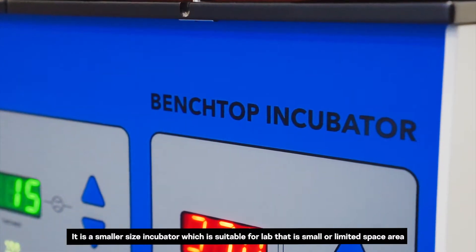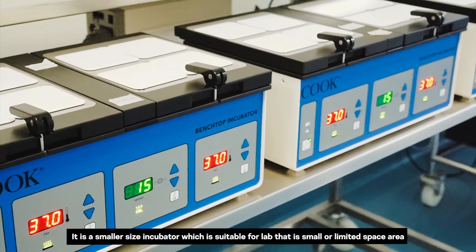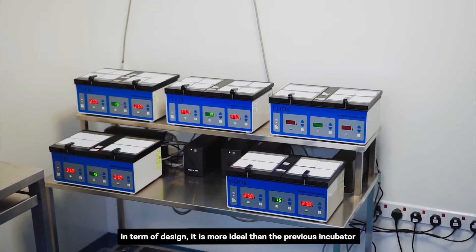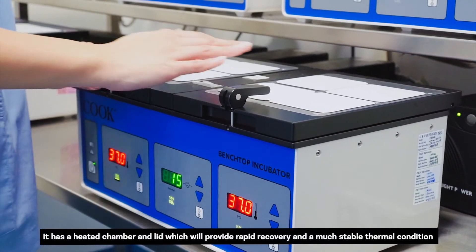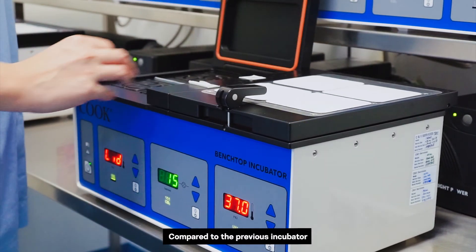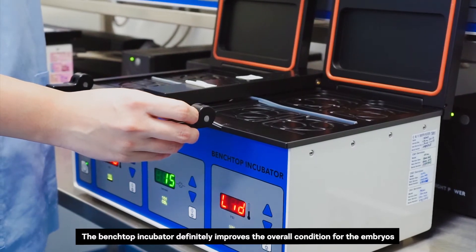Here we have another type of incubator, the Ming Benchtop Incubator. It is a smaller size incubator suitable for labs that are small or have a limited space area. In terms of design, it is more ideal than the previous incubator. It has a heated chamber and lid which provides rapid recovery and a much more stable thermal condition, definitely improving the overall conditions for the embryos.